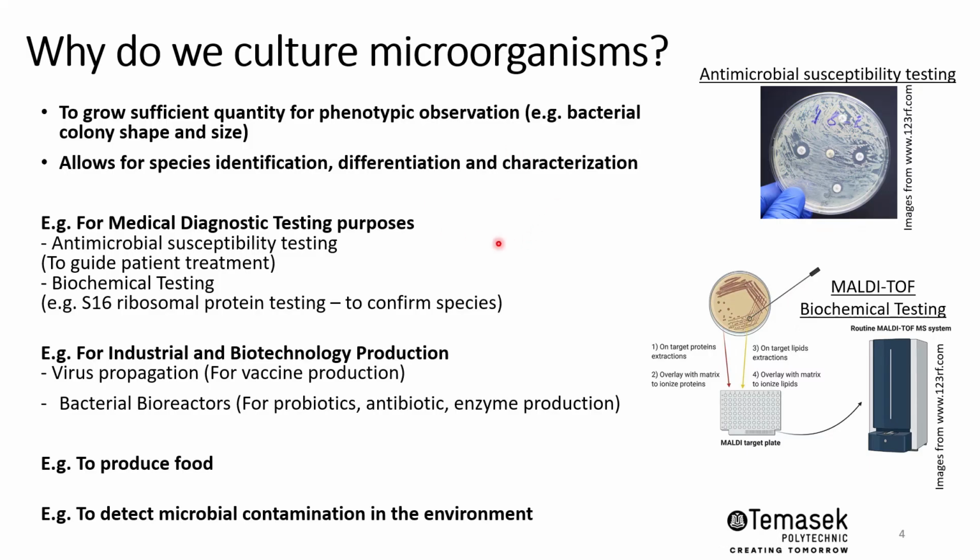So when we have grown sufficient quantities of them for observation, typically we will subject them to testing. Okay, in the field of medical diagnostic testing, we will subject them to antimicrobial susceptibility testing. You can see on the image here on the right, this is how we perform antimicrobial susceptibility testing. These white discs here are actually the antibiotic discs that are placed on a lawn of microbes. This could be bacteria in nature.